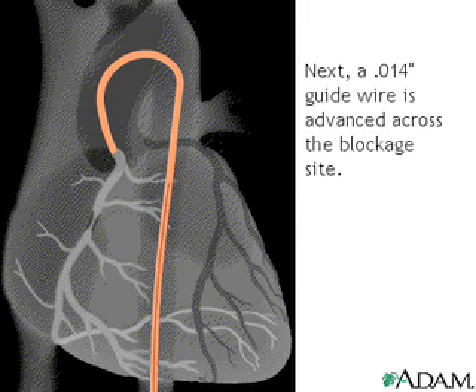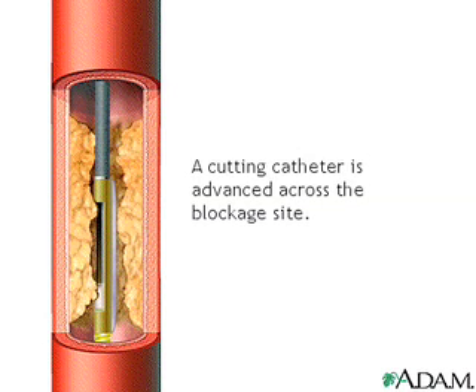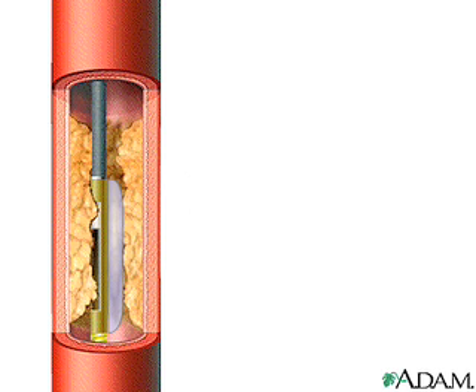Once the guiding catheter is in place, a .014 thousandths inch guide wire is advanced across the blockage. Then, a catheter designed for lesion cutting is advanced across the blockage site. A low-pressure balloon, which is attached to the catheter adjacent to the cutter, is inflated such that the lesion material is exposed to the cutter.